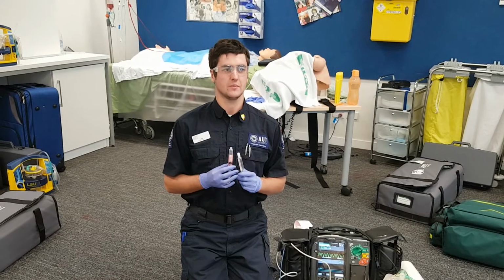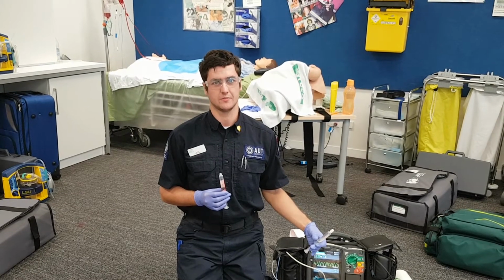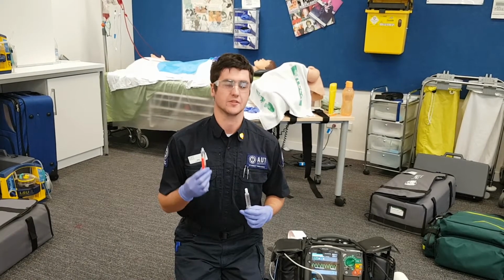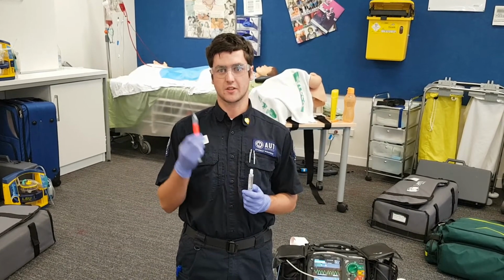My patient, because he's in conscious VT, I'd like to sedate him first before I have to cardiovert him. I've called up clinical desk for guidance on giving ketamine for sedation, and I have drawn up, after getting my off-sider check, that I've got ketamine.